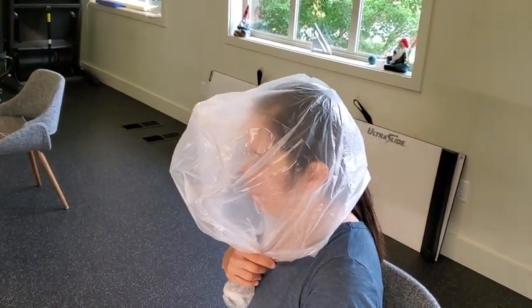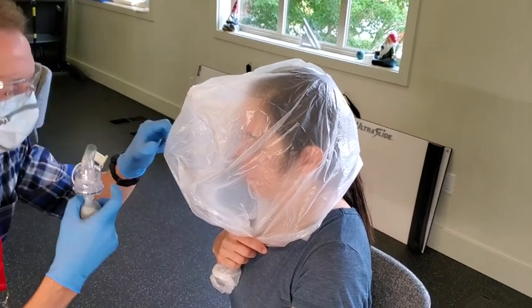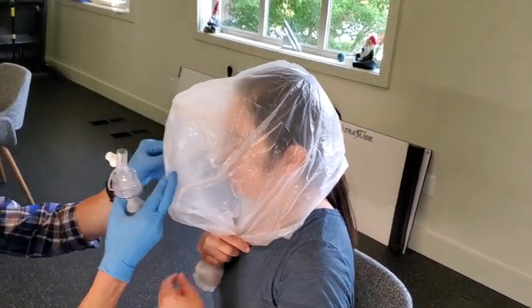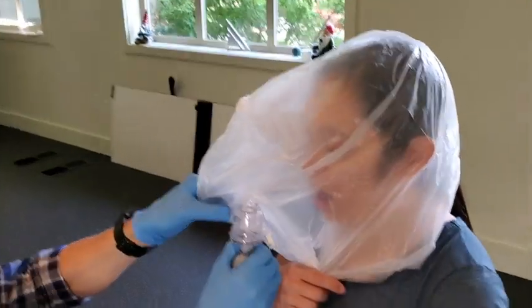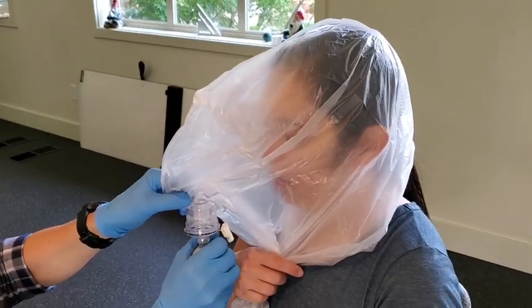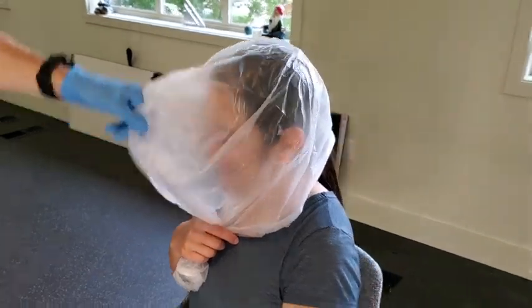I'm just going to make a little snip. And then with the sensitivity one, I'm going to do these puffs through the hole, and you're going to open your mouth and breathe normally. Yep, straight away? Okay, good. Let's take that off.